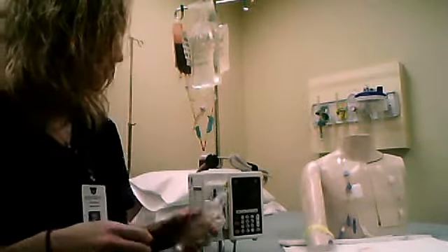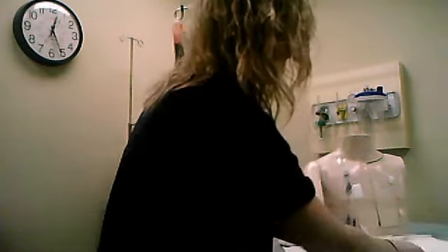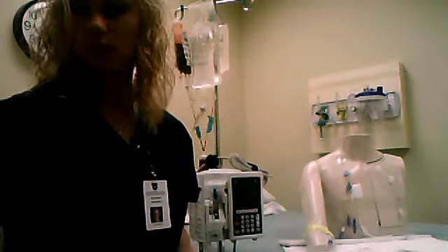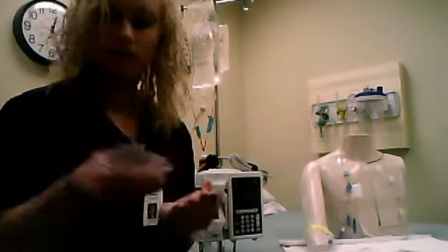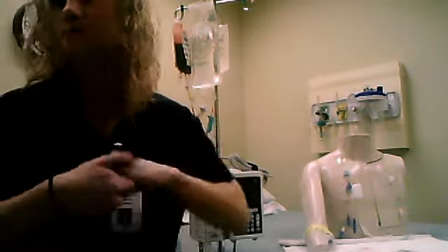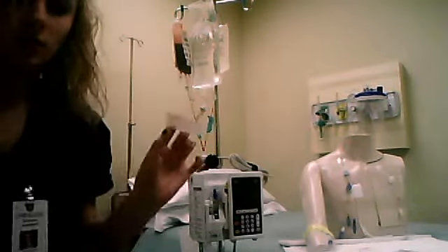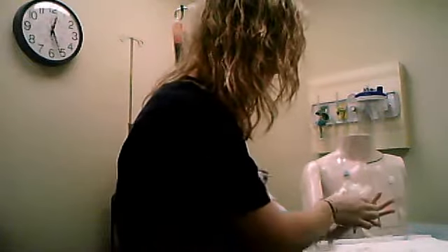Hello, Pat. My name is Samantha. I'm your nurse today. I hear you've been having some chest pain. Can you rate your pain on a scale of 0 to 10, 10 being the worst? Okay, so he tells me his pain level and the type of pain possibly. I'm going to wash my hands. We've also got a label made up to put on this dose, so we don't get confused.